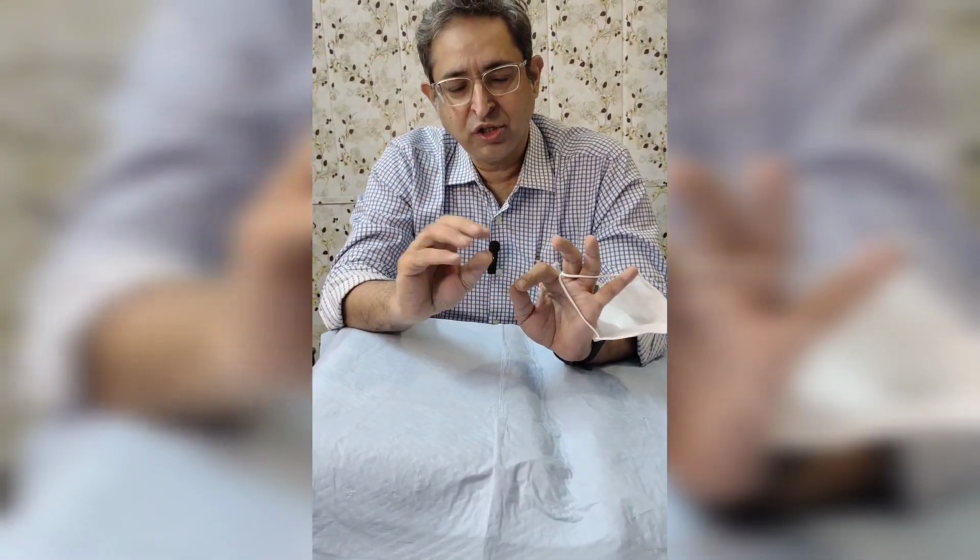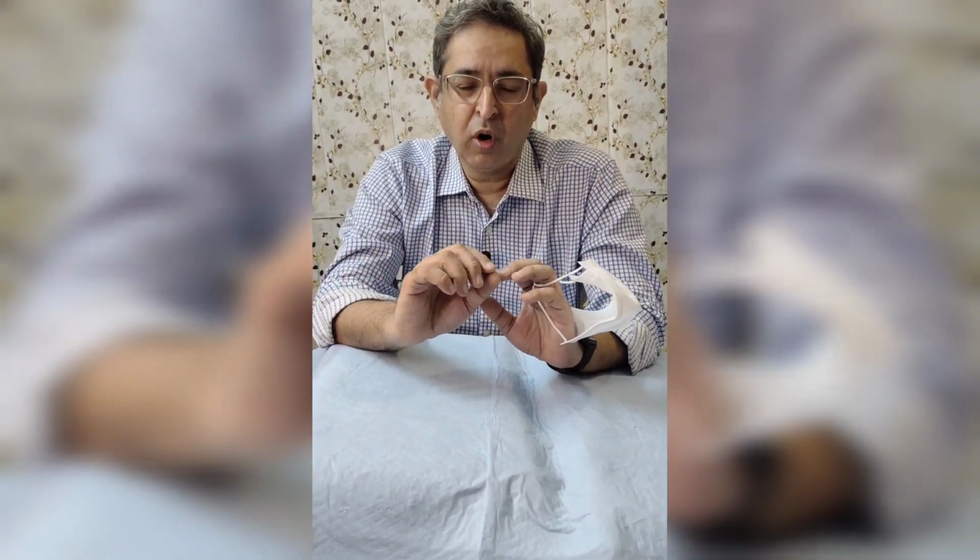So observe carefully what steps I am doing and how I am doing it. What you have to keep in mind are the steps, and if you do it in a sequential manner, you will not forget it.